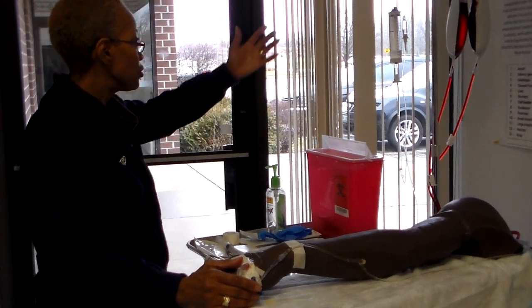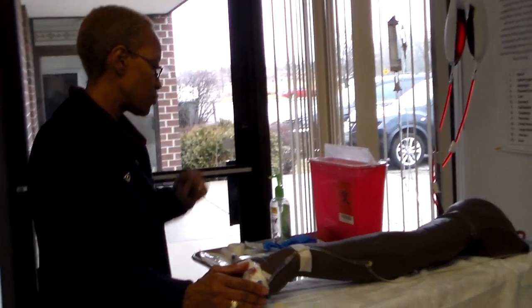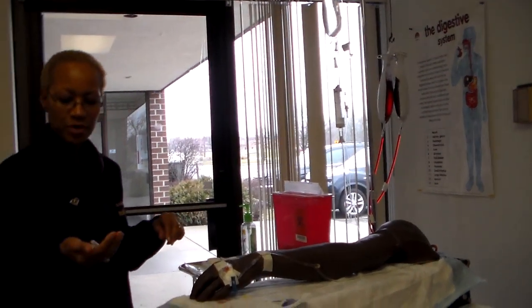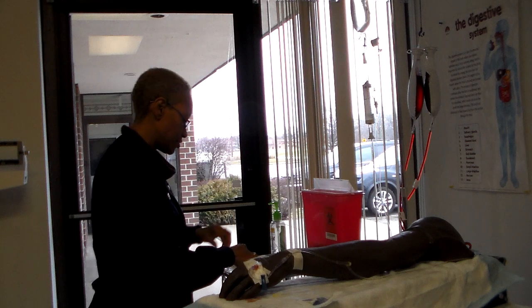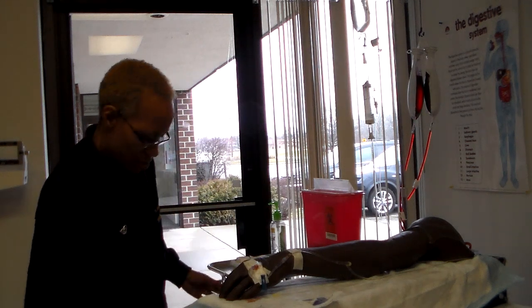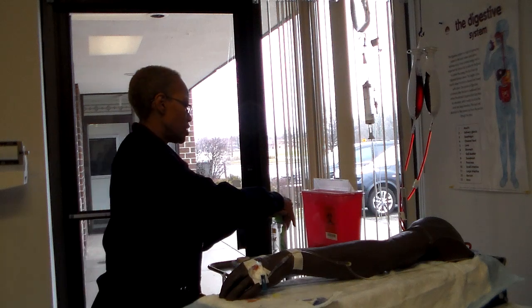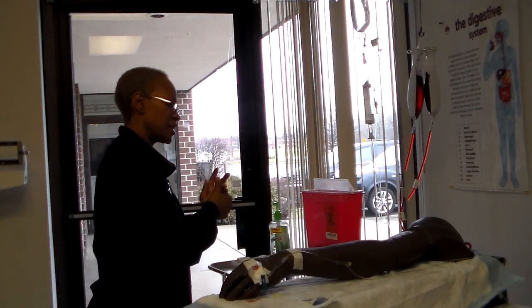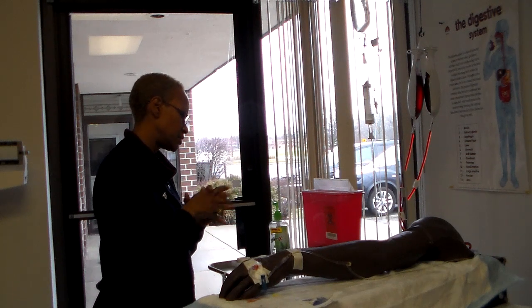And I'm going to make sure that my IV is flowing, that it's dripping, or if it's on a pump, that it's set at the rate that it was ordered at. And I'm going to make sure I dispose of everything. Remember, anything that's not a needle, don't put it in your biohazard container. Just throw it in the garbage. Clean up. Do my hand hygiene. Ask my client, how does it feel? Is it painful? Do you have any problems?